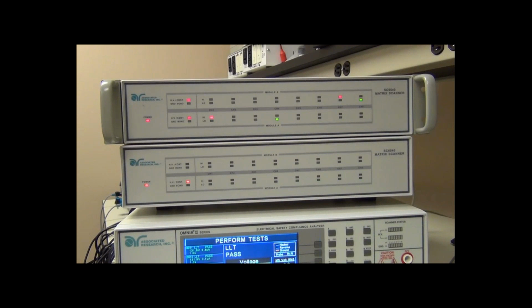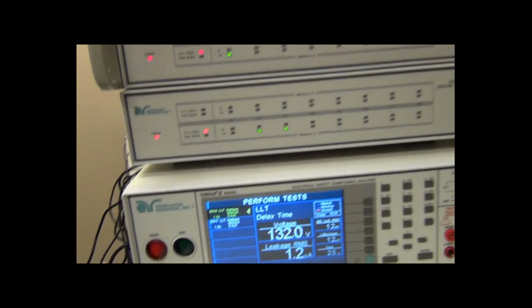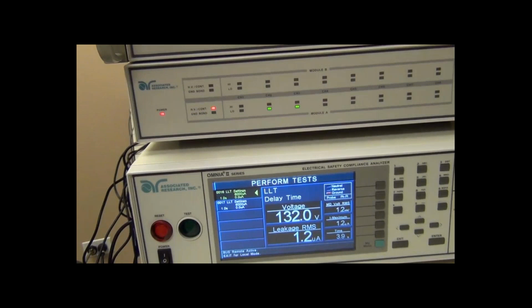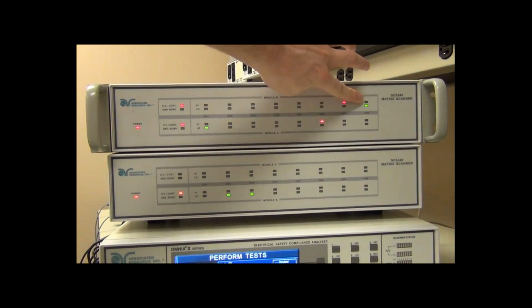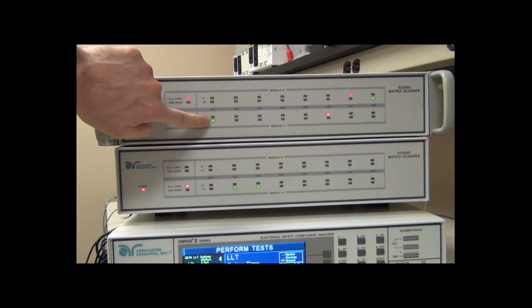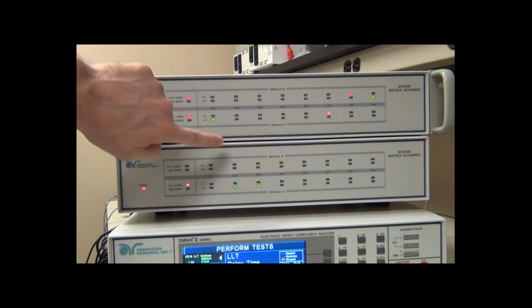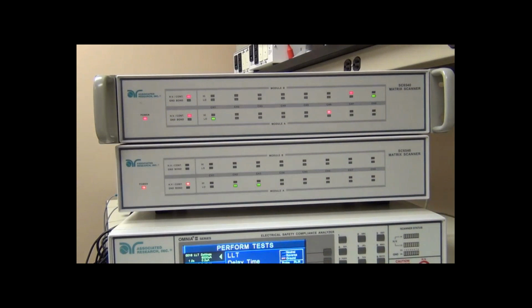And here we can see, getting a little more leakage, only about 1 microamp in this case. But now we have probe high to probe low, line voltage connected to probe high, which is channel 6, and probe low connected to patient lead 1. At the same time, on the other scanner, I've shorted my neutral to my protective earthing point because I've tied those points in there.